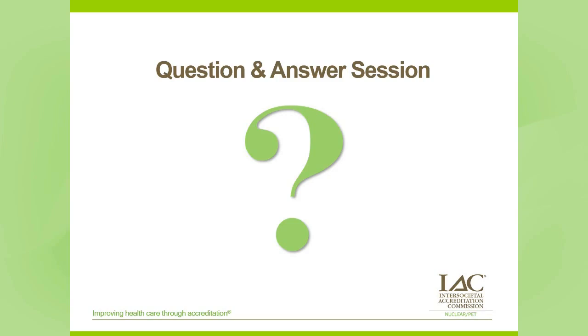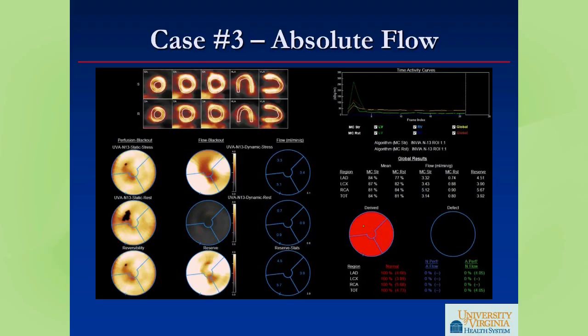So we definitely look at the curves. If you look at the curve here, what you should see is a very robust peak as the blood flow goes into the RV, and the same thing in the LV, and then you'll see a small or much smaller increase that then remains steady in the tissue.